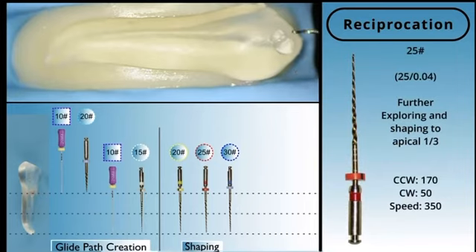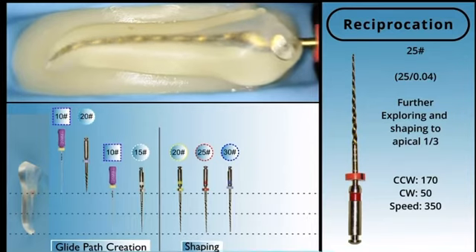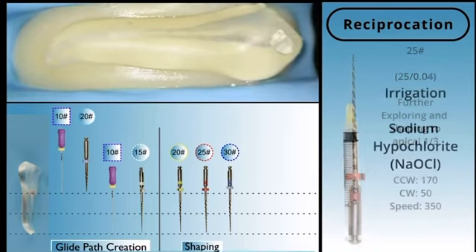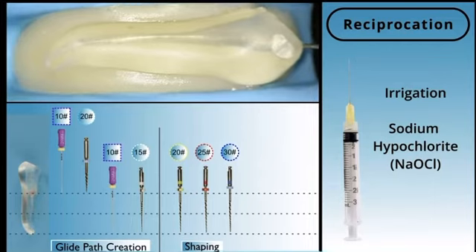And because the size 20 file went quite easily to length, I'm going to go up with a size 25 file. Again, significant debris at the apical third and a little bit of extrusion.